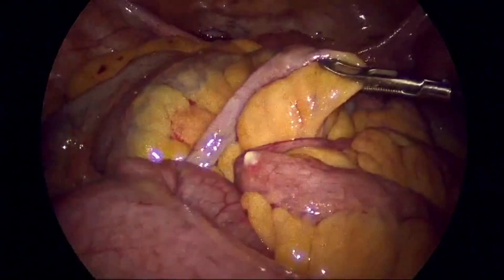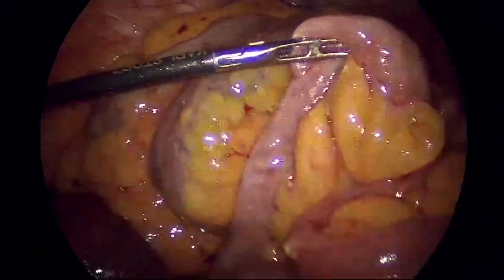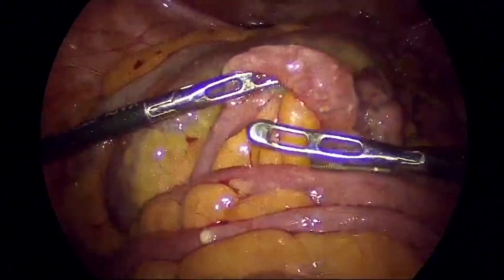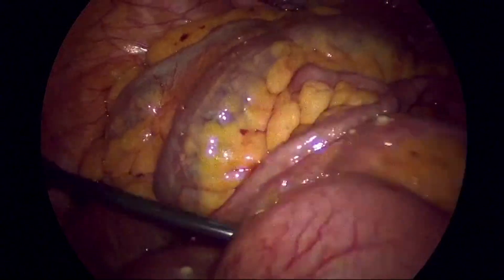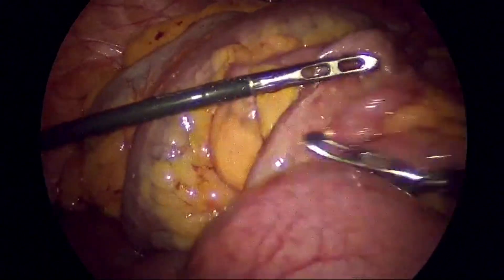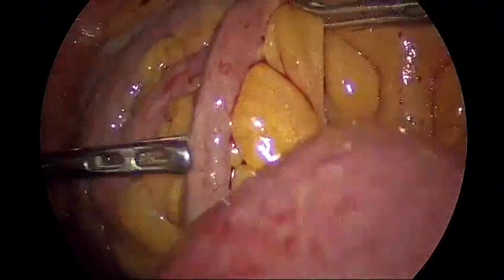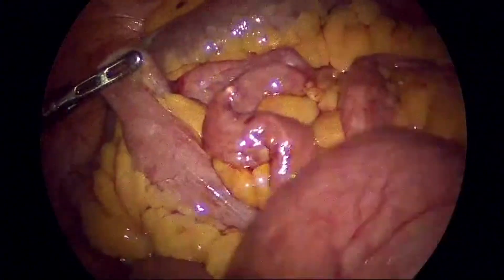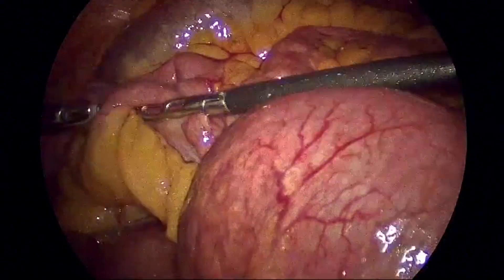After reaching the area of the mid ileum and proximal ileum, we could see that the bowel walk was becoming difficult. We thought there might be some adhesions, and as you can see, we are trying to hold more of the fat or the mesentery than the bowel wherever possible.